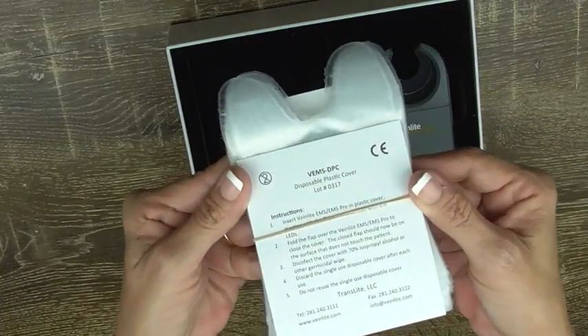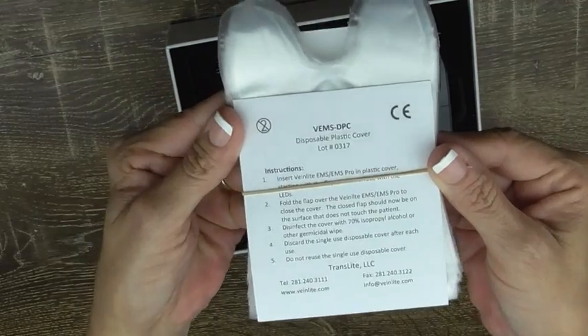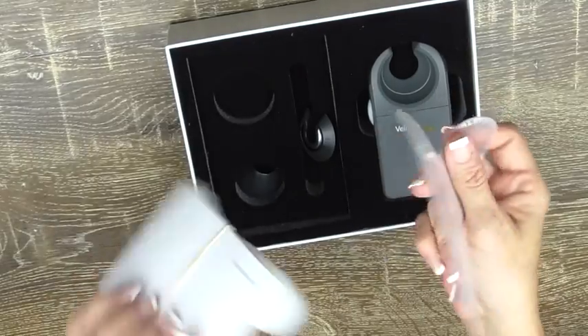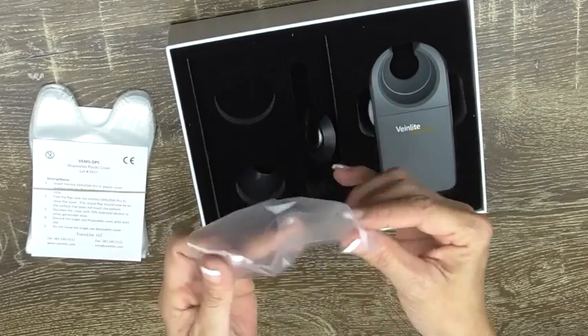It comes with a stack of plastic disposable covers, so you just slip your EMS Pro into the cover.